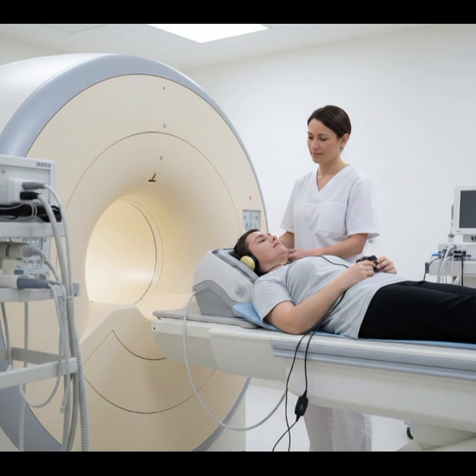Finally, compare pre-contrast and post-contrast T1 images. Enhancing lesions will appear brighter after contrast injection, and their distribution can be confirmed in axial and coronal planes.